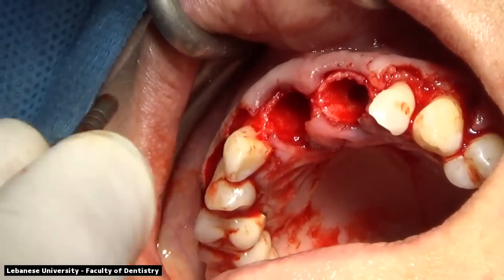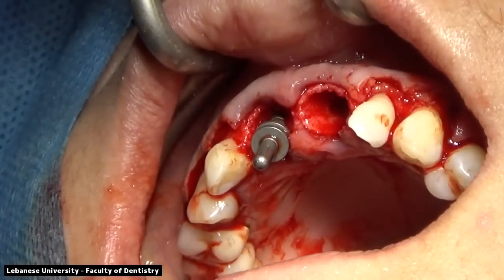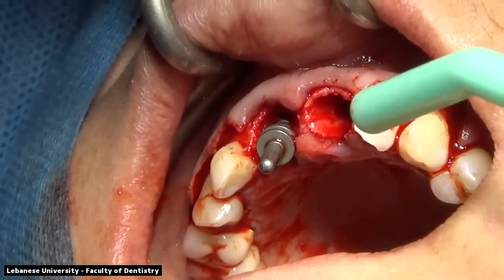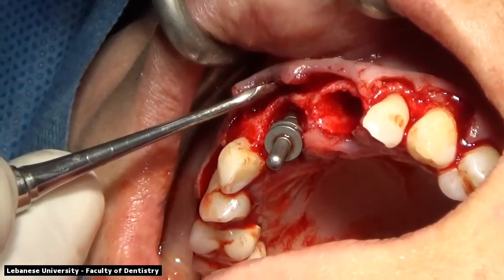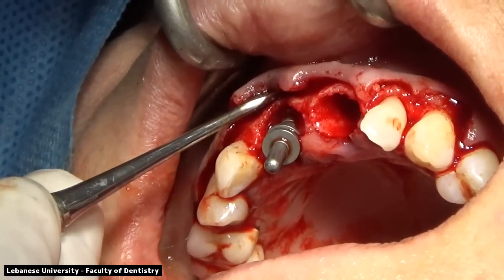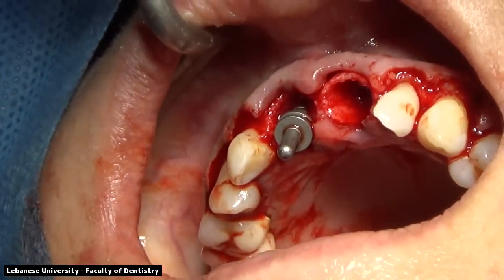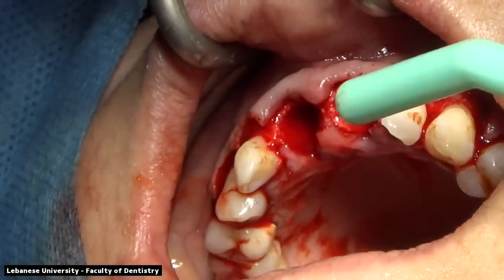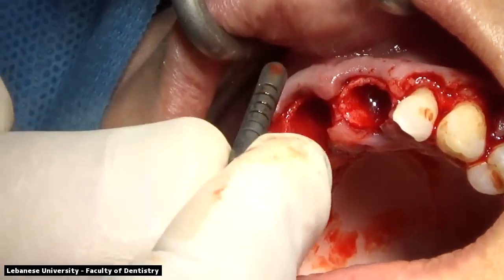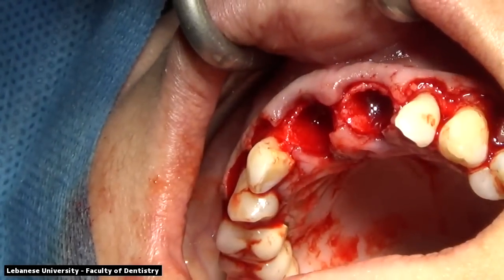So once we look into the socket, now we're going to appreciate that there are almost two sockets. There's one on the palatal side, which is the drilling side, and there's our original socket. And we have to make sure that we do not slip while we're drilling and go to the original socket, which will give us less engagement and improper orientation of our implants, as well as buccal plate bone loss and some recession and dehiscences on the buccal plate. So always make sure that you're going towards the palatal.